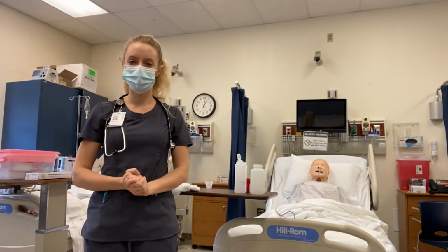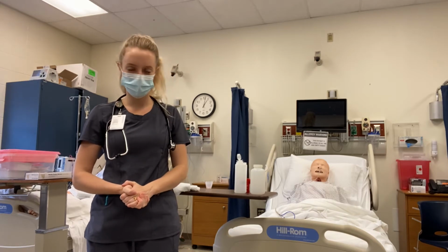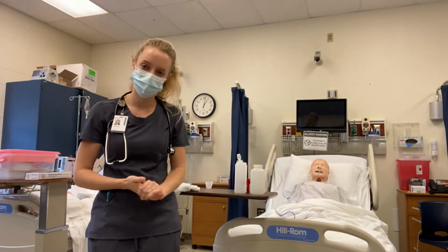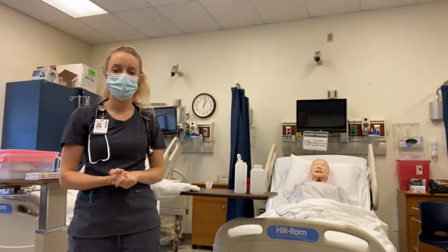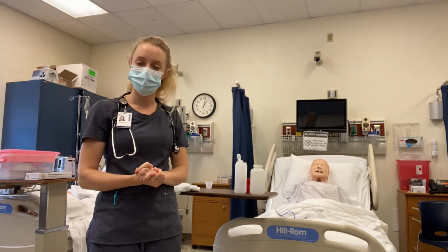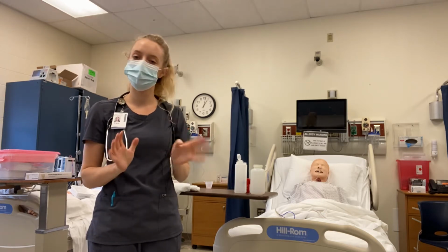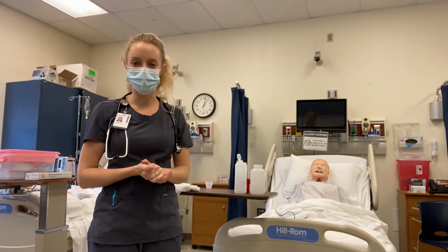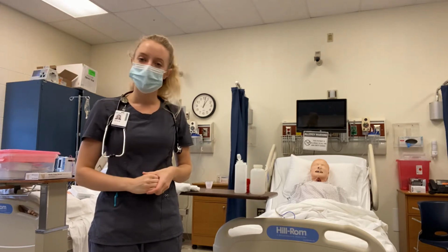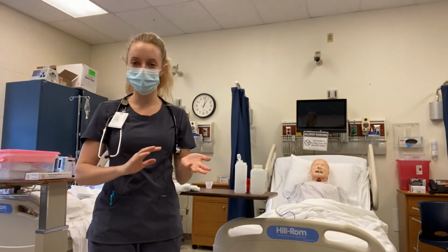I'm a 7th semester nursing student, and today I'll be demonstrating the skill of administering a medication through an enteral tube. Before I begin, I want to make sure that if my patient is hooked up to suction, that is discontinued and ceased for about 20 to 30 minutes after administration of medication to allow absorption. And if he is receiving a tube feeding, I want to discontinue that as well.